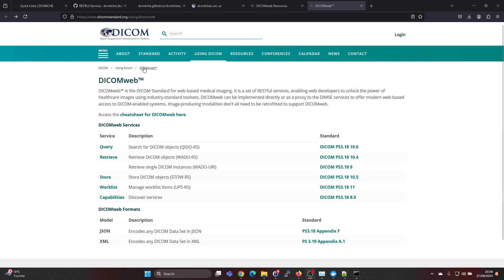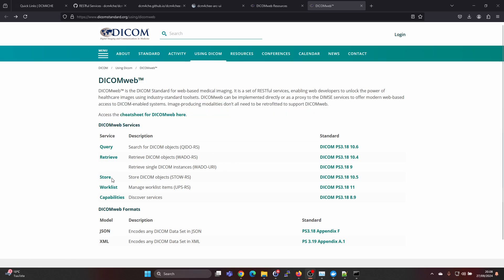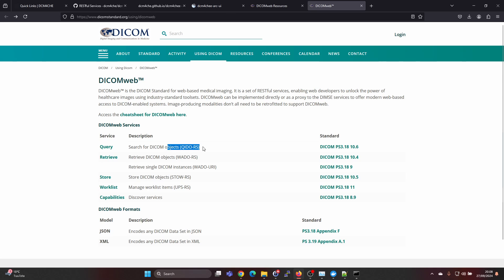Here on the DicomStandard page we can see that DicomWeb is the DicomStandard for web-based medical imaging. So it's a set of RESTful services which allows you to query for studies. This is called QidoRS for searching for studies.